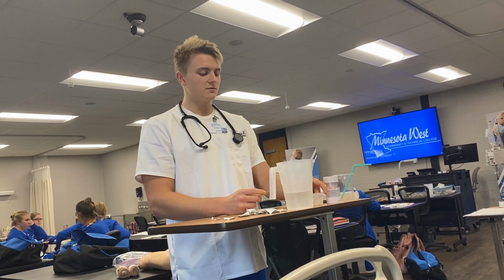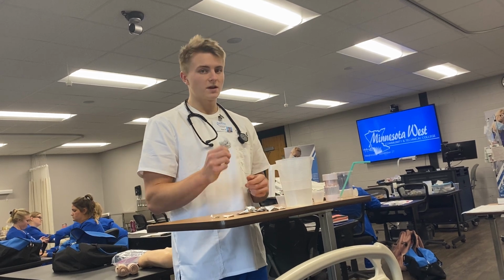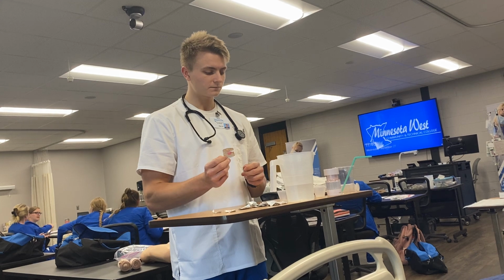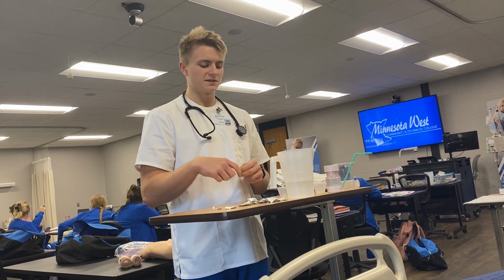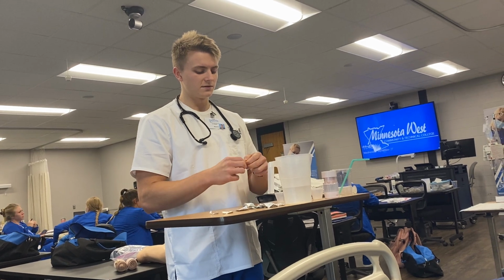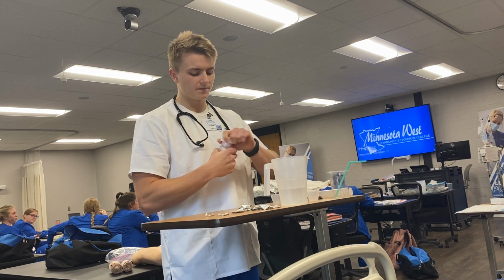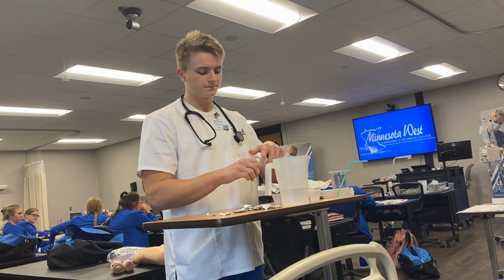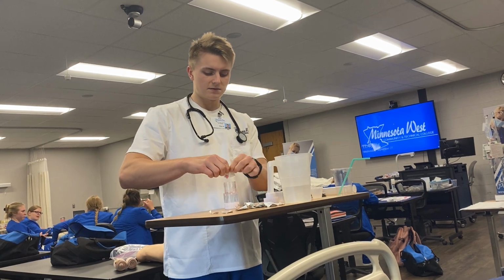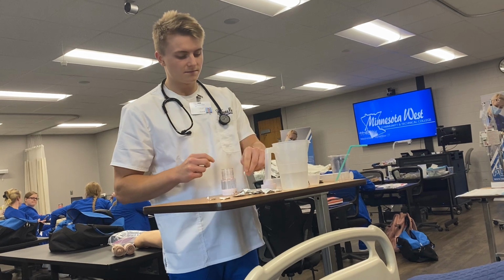And so I know that the route is going to be nasogastric, so I'm going to have to crush this pill if indicated, if not contraindicated by the pill. If it's a capsule, I'm going to open that. If it's a liquid, I'm going to pour it in. So because we're going to have to crush that pill, I'm going to take the pill. I'm going to put that pill in the pill crusher. I'm going to save the wrapping it was in.